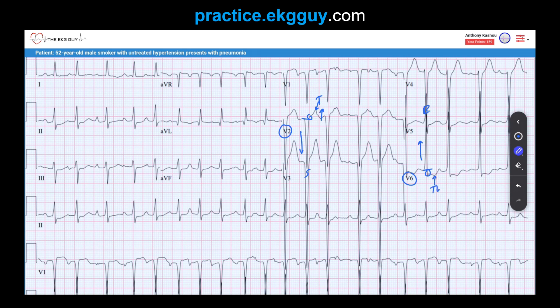In summary, ST elevation with upright T-waves is seen in the right precordial leads, and ST depression with T-wave inversion is seen in the left precordial leads. With right ventricular hypertrophy — which is not present here — you would see the opposite pattern: ST depression and T-wave inversion in the right precordial leads.